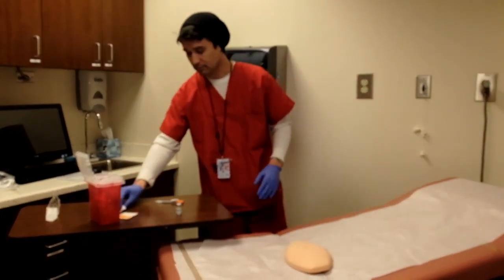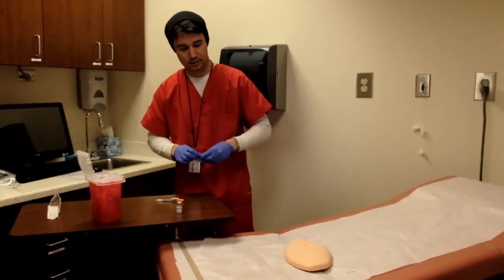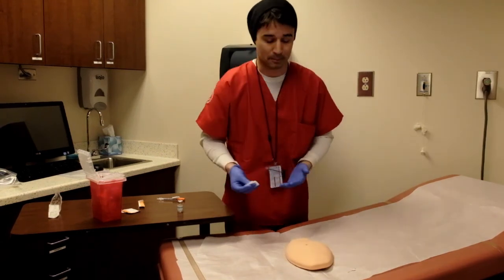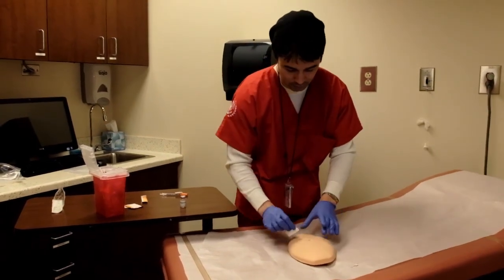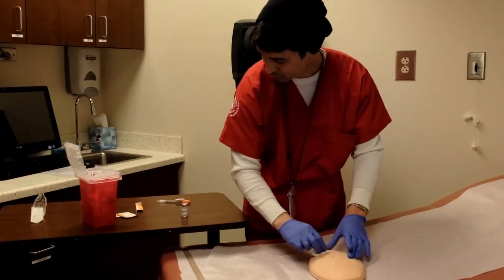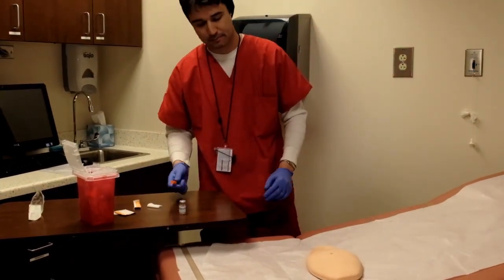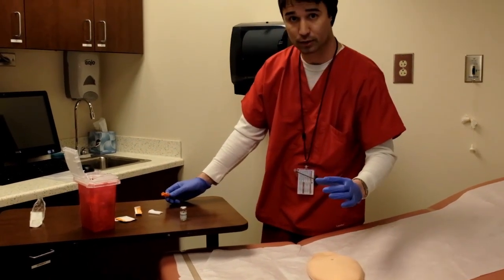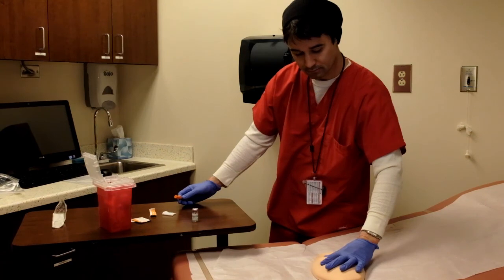Once we've done that, we'll take our alcohol pad, and we want to clean the area that we're going to be injecting the medication in. Usually a circular motion, in, out. Okay. So go ahead and grab about a 1 inch fold of the skin.